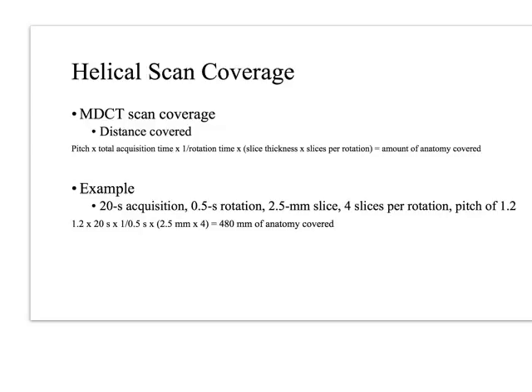But you'll be given this information: a 20-second acquisition time, a 0.5-second rotation, a 2.5 millimeter slice thickness, a 4-slice machine, and a pitch of 1.2. If I have that material, I can tell you how far of an area the scan will cover.